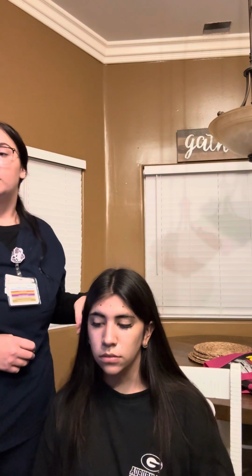For the circumference, we get 10% of the 54.5, so it's 5.45. That's how we get the F7 and the F8.